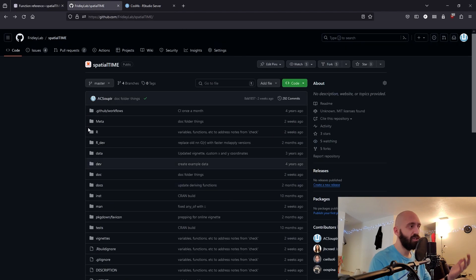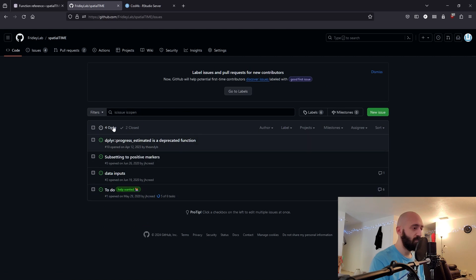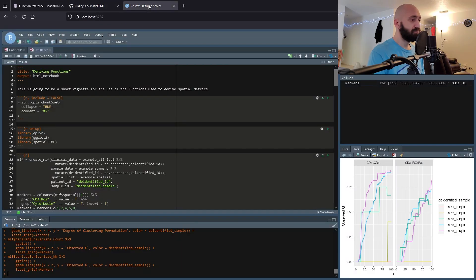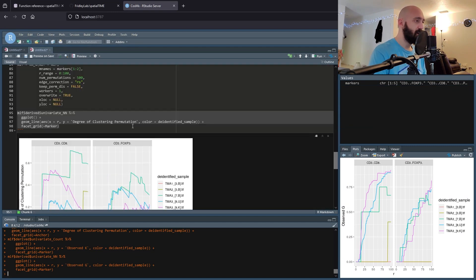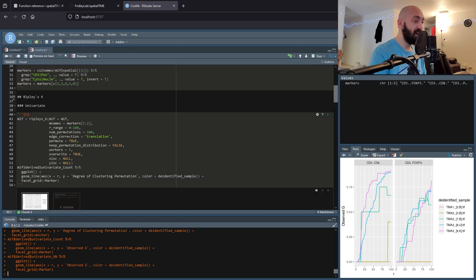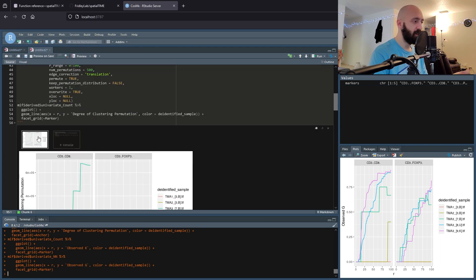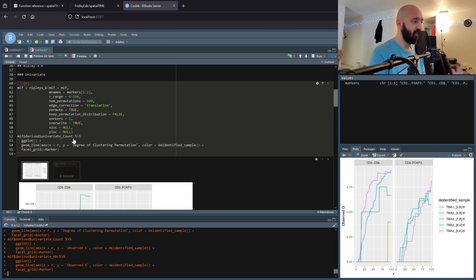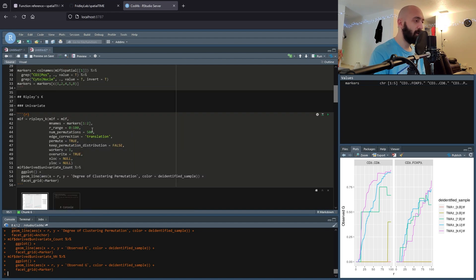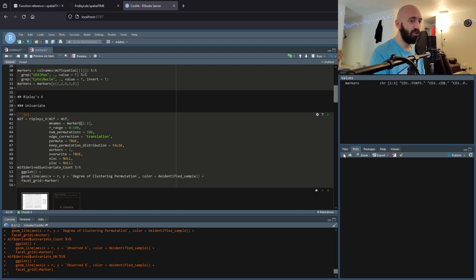To look at all the different functions, we can go to the reference page, or also the GitHub page itself where you can leave issues. Jumping into RStudio, we can see here I have the first four functions — univariate and bivariate for both Ripley's K and the nearest neighbor G — plotted as shown in the vignette. I did increase the number of permutations since we're only doing two markers.